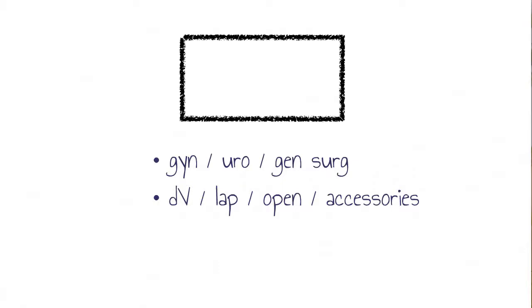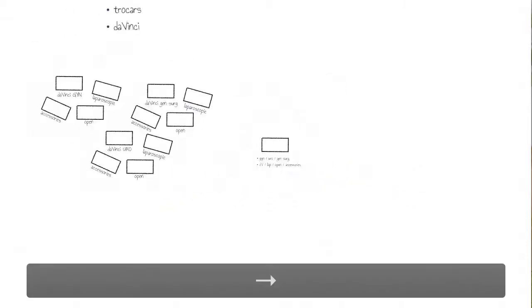It's going to help your folks in central sterilization. They can create patterns of how they're going to sterilize stuff because it's the same every single time. One simple act of standardizing a tray will impact multiple areas of your hospital in improving the efficiency with which they can function. Reducing variability improves efficiency, improves quality. All these things are important to building our daVinci surgery program.